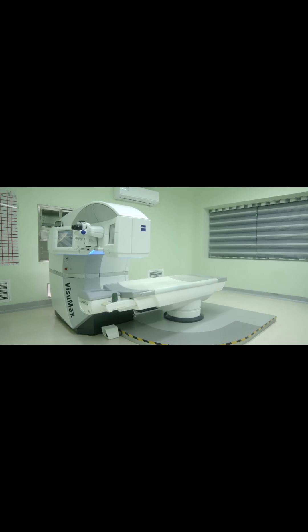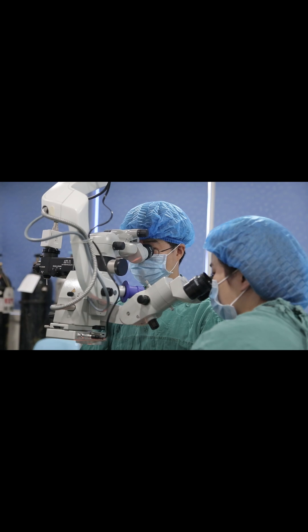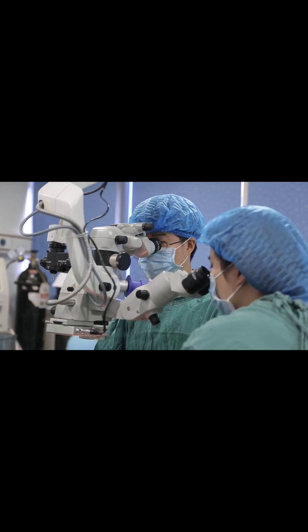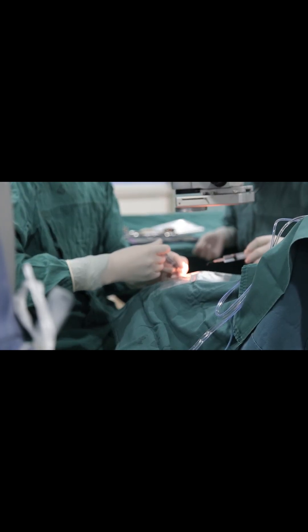There are many ways to perform a superficial keratectomy. First, anesthesia is used to numb the surface of the eye. In addition to topical anesthetic, some ophthalmologists also prefer intravenous sedation — medicine given by injection in the arm or hand to help you relax and block pain — or an oral sedative to aid in pain control.